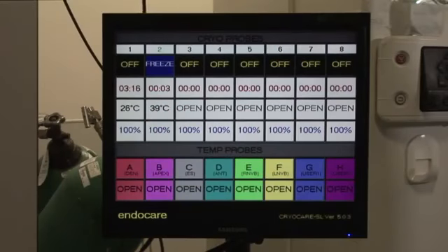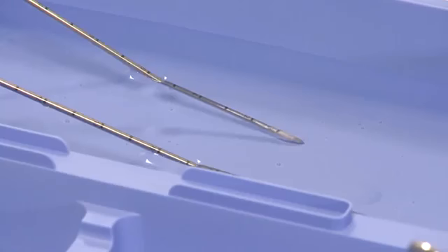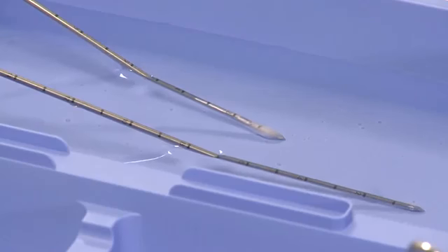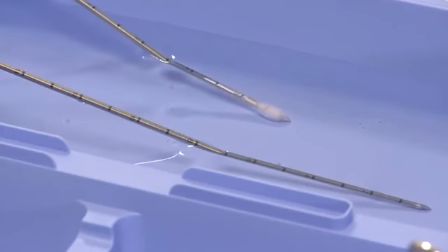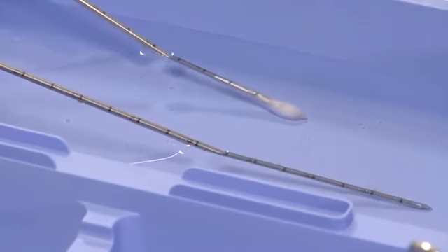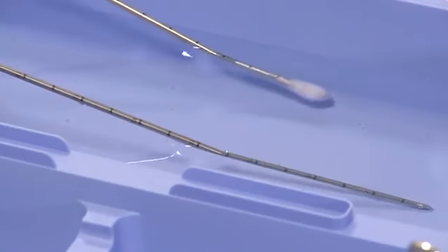That noise you hear is the gas escaping from the machine. That's an important noise to know that things are going well. If you put your hand down there, you'll actually feel the flow of the gas. Both gases vent from the machine and you can feel it coming out. Got this ice ball forming already. What's our time, Michelle? 30, approaching 30 seconds. So 30 seconds is a good time. We've got a good probe. Let's hit thaw just to get the ice ball off.